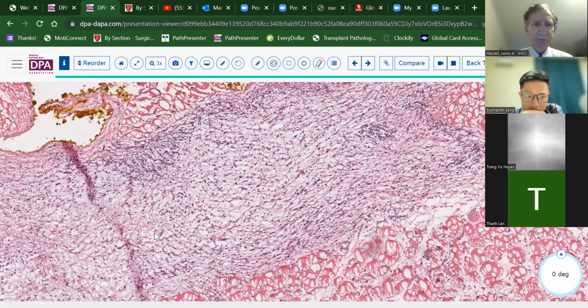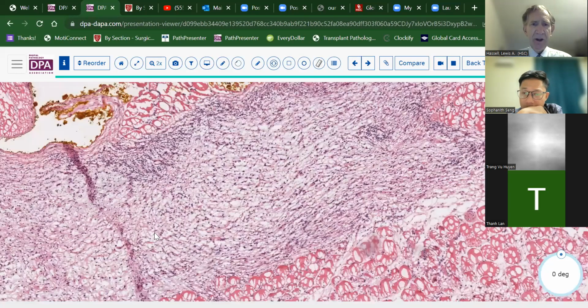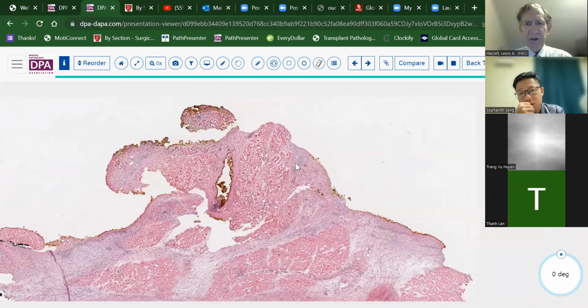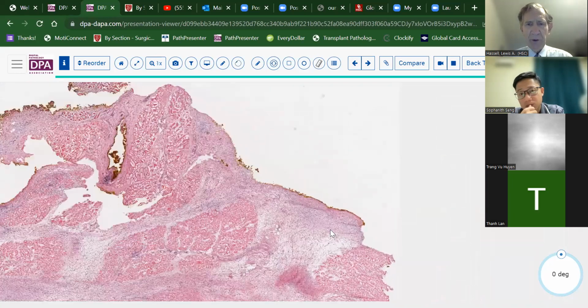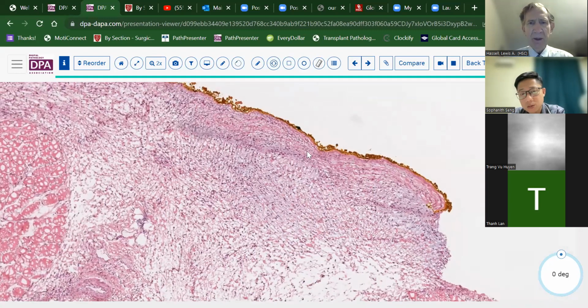But seeing the contiguity between this area and the other areas of the tumor would help us to be convinced that at least this area is positive. Other areas like out here might be more difficult to state with certainty that this is tumor, although here I think we would also probably call this tumor at the margin.